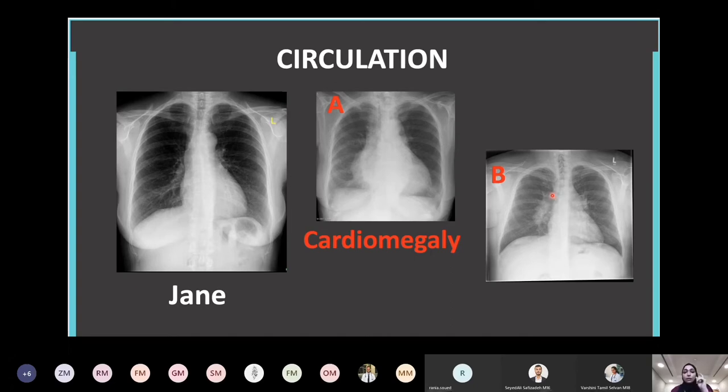Yeah, so those are enlarged lymph nodes or lymphadenopathies. This usually happens from infections, or cancers or tumors that have spread to other areas, but usually infection, etc. So it's right there. Look how it's dense and it's white. There's a little bit of opacity over here.